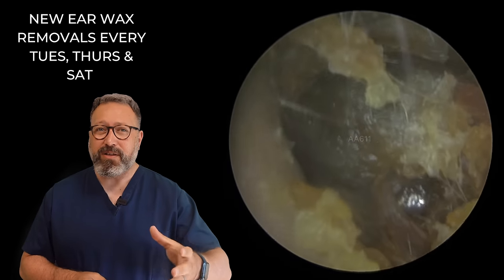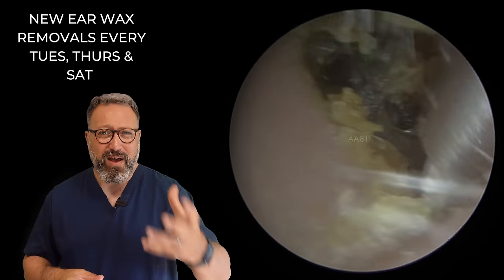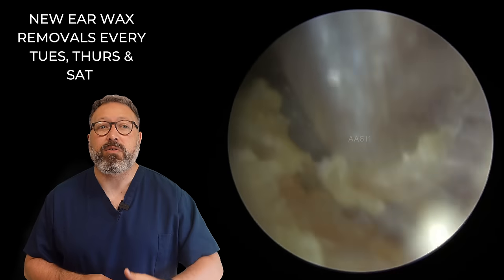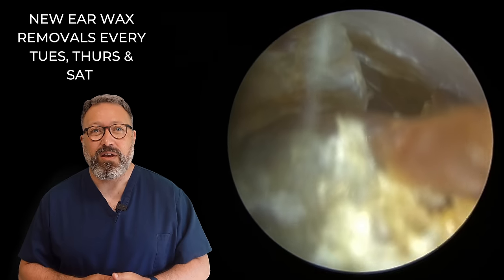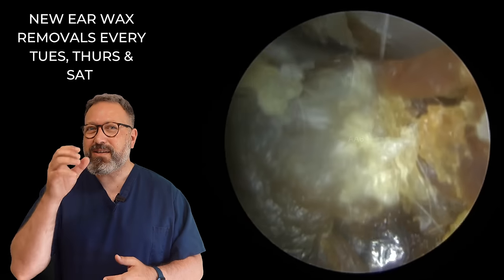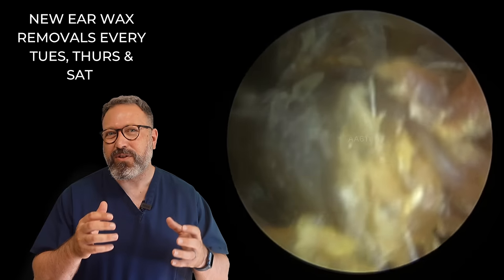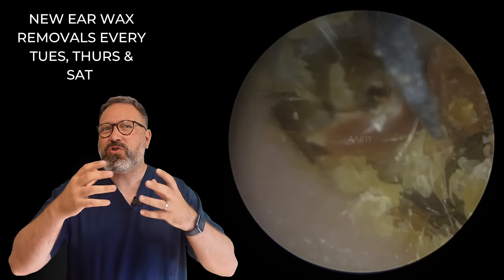Now this one is very similar — this is the patient's other ear canal. You can see there's dry skin, there's a plug of wax, there's all sorts going on in this one as well. As soon as I put the suction in, it picked up a little flake of dry skin from the canal wall, and we're just starting to pull these little bits down. As we did on the other side, loosening it from the canal wall. Now I'm checking — there is a tiny little gap, small enough to get the Rosen Inserter in. If the wax is hard enough, the Rosen Inserter should be able to pull that whole plug forwards. But what you'll see is that the wax isn't as tough as it was on the other side — we've got a slightly hardened piece of wax with a very soft core to it.